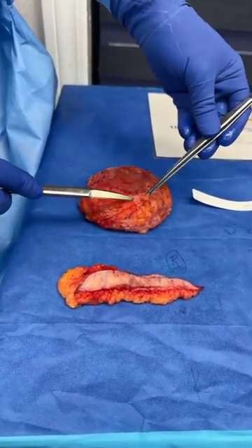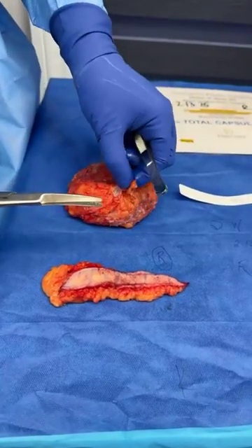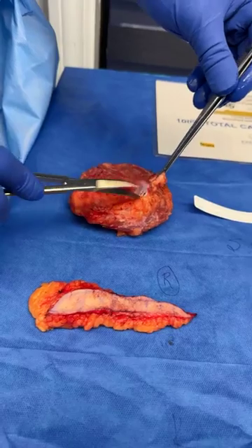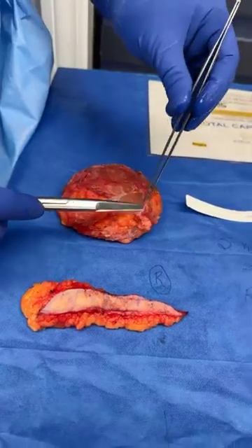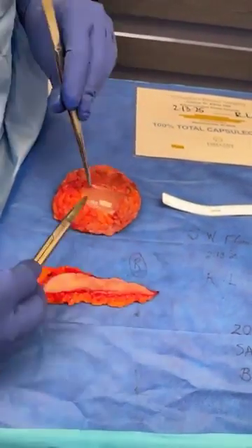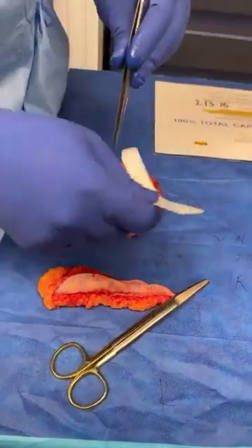And as you will see, it's scar tissue, right? This is that capsular tissue, and it's not healthy tissue. As I touched it, it's nodular, it's irregular, and as I cut this open, relatively very small implants. And again, as you will see, as I go in, you can see how thin the capsule is. If I take the ruler, you can see how transparent thin this is.